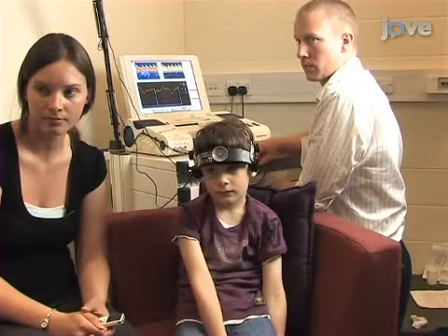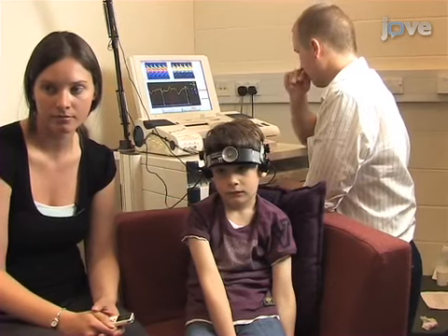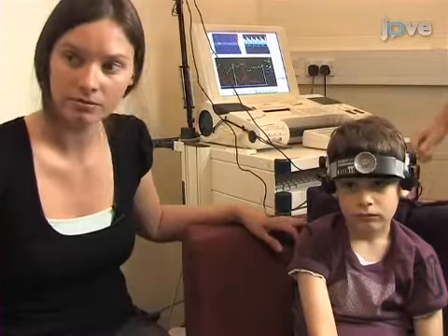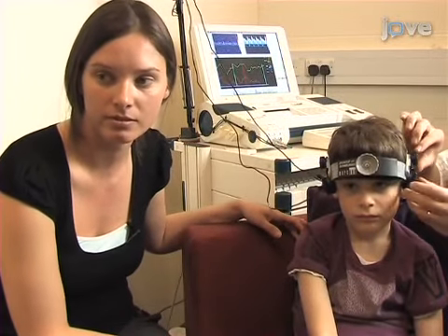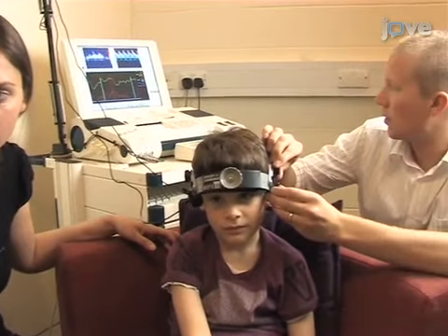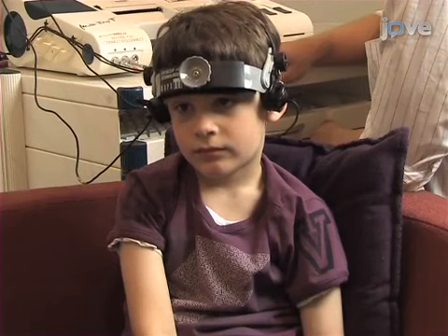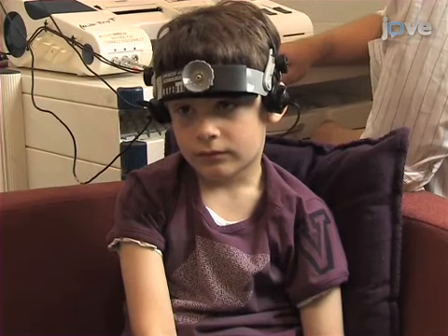A second experimenter should monitor the multi-dop to make sure that a suitable signal is maintained. If the signal becomes significantly disrupted, pause the display computer and readjust the probes, applying more gel if necessary. Monitor the child's behaviour and ensure that they are comfortable and relaxed.